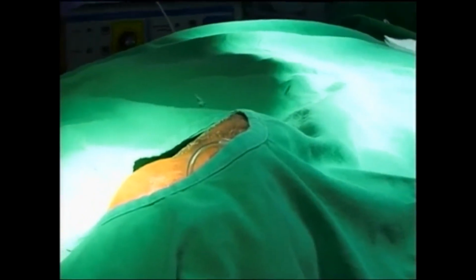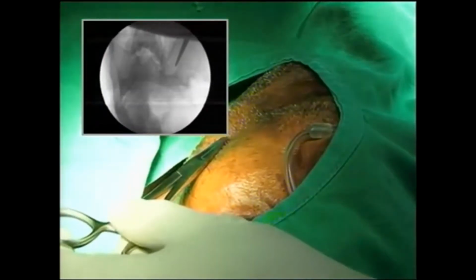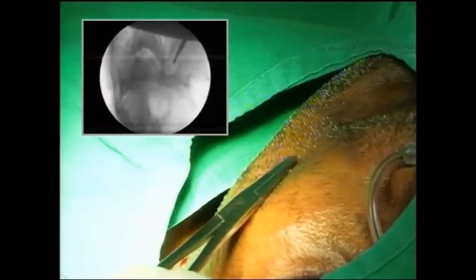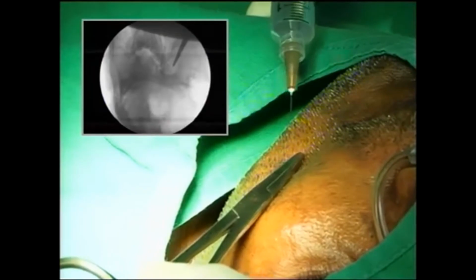For the maxillary nerve, you'll be selecting the center of the foramen ovale. If it was mandibular, I would have gone to the lateral aspect. If it was ophthalmic, I would have gone to the medial. So that's my point of entry, somewhere in the middle. Okay, I'm going to drop a little bit of local anesthetic there. Small injection.